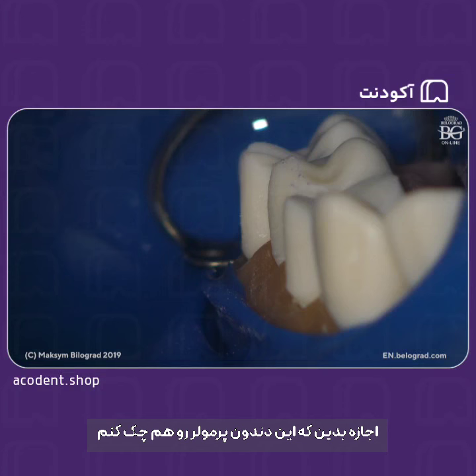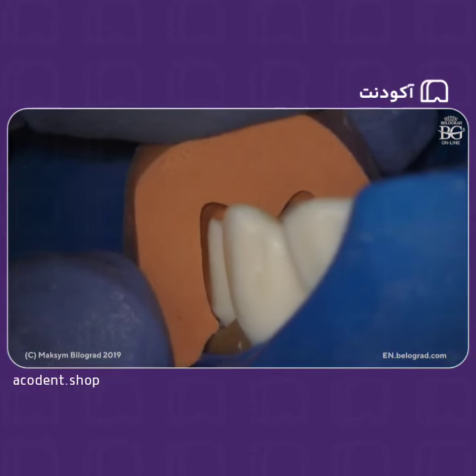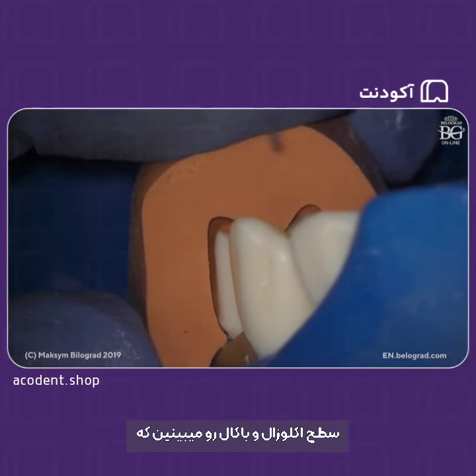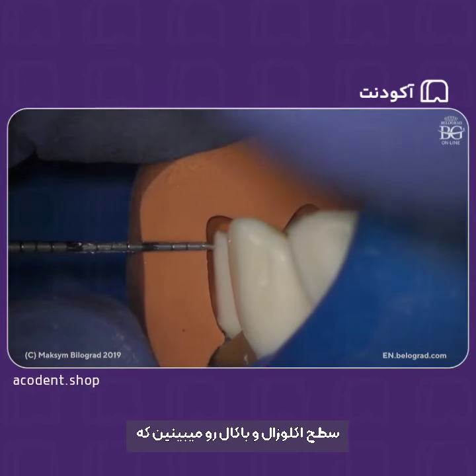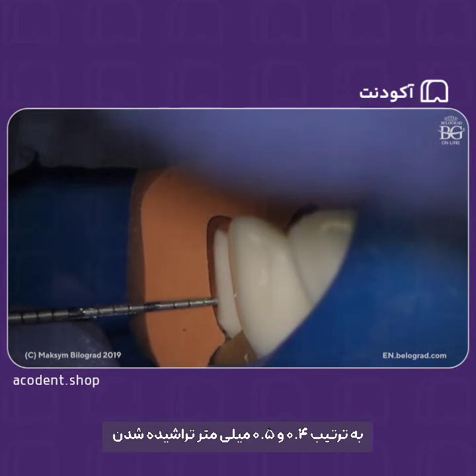Let me just check also this premolar, to be confident that everything is fine. Okay, the occlusal surface and also the buccal surface 0.4, 0.5.